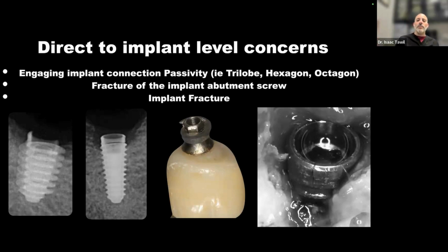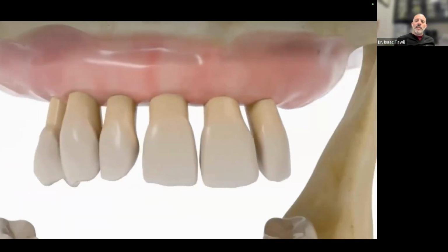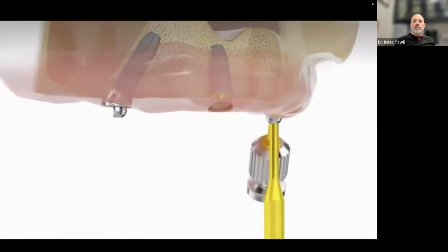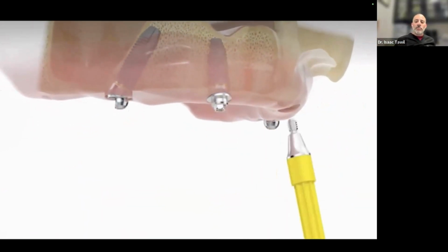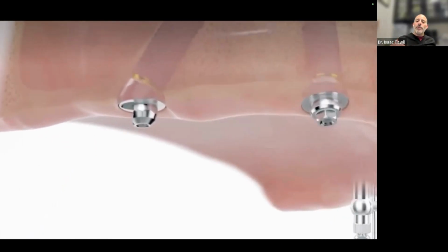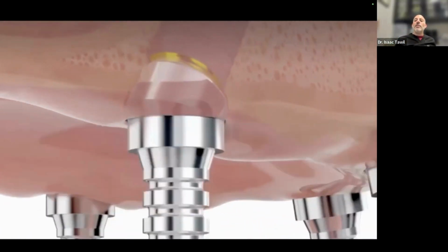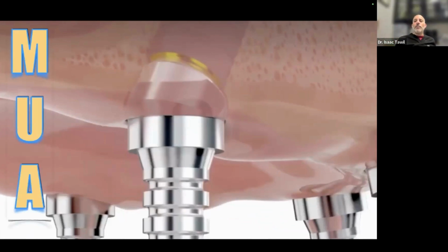I'd much rather have an intermediate abutment, which is my solution to overcoming this direct implant phenomenon. So instead of sectioning up bridge work and trying to get that done, we follow the all on four type of technique. We can do more than four. We can do 6, 8. We don't have to angle. We can put everything in straight. I like to use straight multi-units whenever possible. And then once we get to this multi-unit level, we then can go into that next step and decide how we even want to temporize the patient.